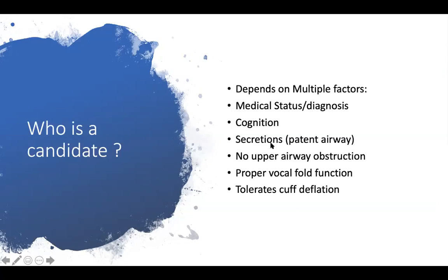Secretions. If the patient has a lot of secretions, they might not be a candidate for a speaking valve fitting, but there are no scales that can measure the degree of secretions. It's a subjective judgment. Sometimes you would go in and ask the nurse whether he has a lot of secretions, and she would say yes, he's not a candidate for a speaking valve. Then the next day you talk to the respiratory therapist and he would say, well, he has medium secretions.